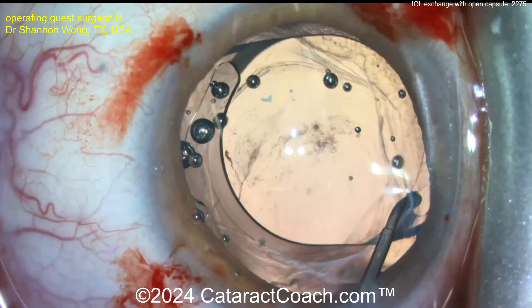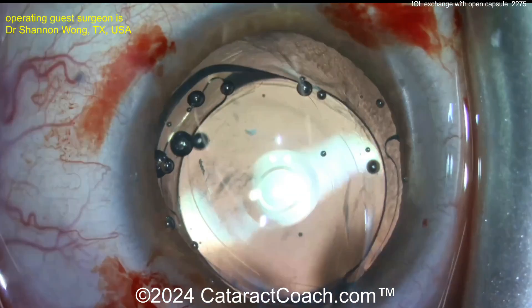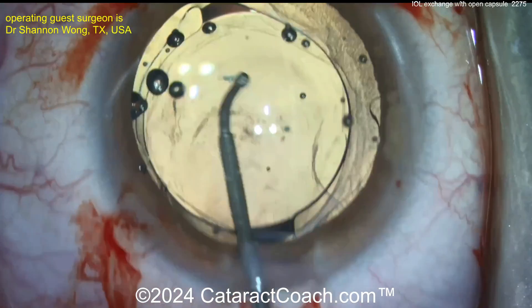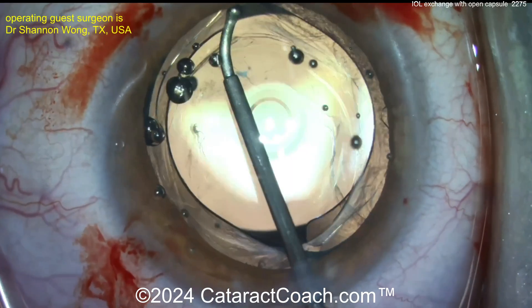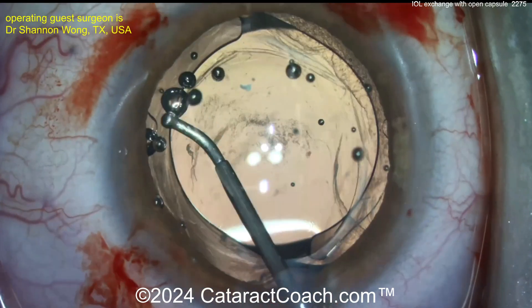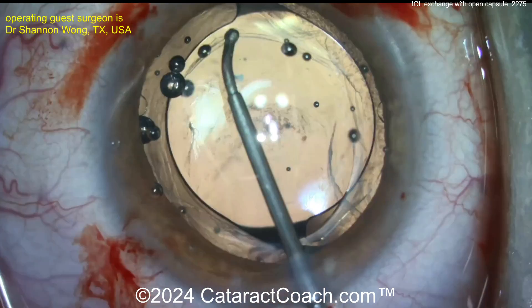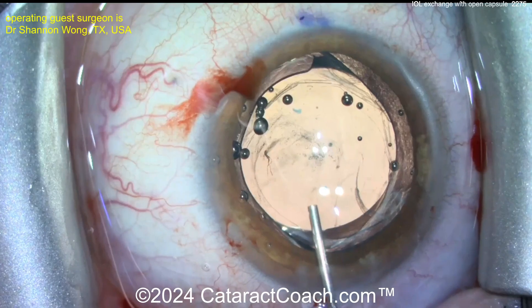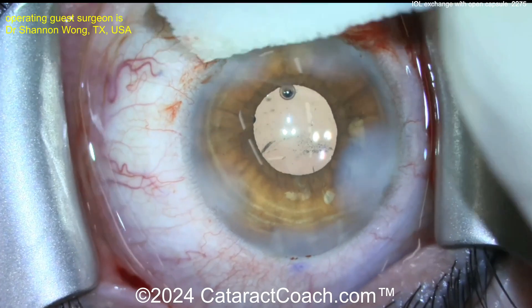If you've done fewer than a thousand or a few thousand cataracts, this may be a very technically challenging procedure and you have to proceed with caution — you can cause more harm than good sometimes. In the worst case, hopefully you can still put a three-piece lens in with haptics in the sulcus and with standard optic capture, where the optic goes behind the capsular rhexis.